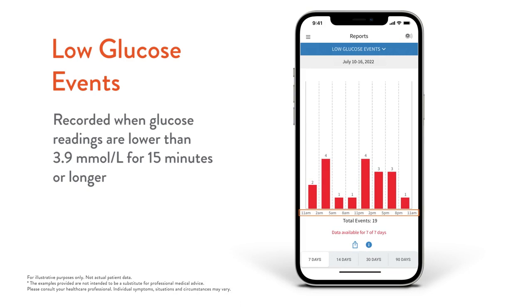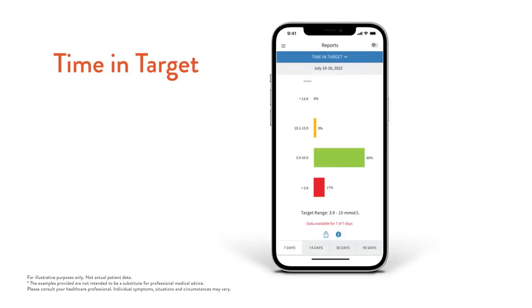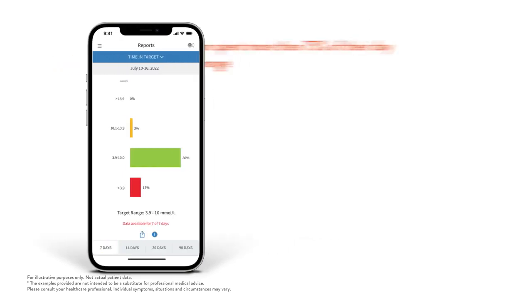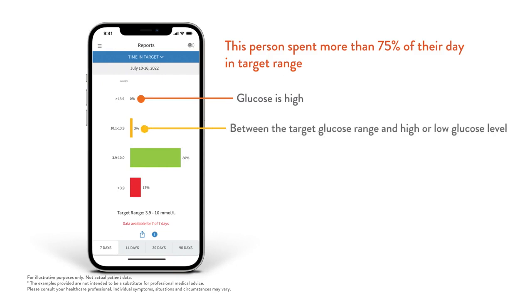Next, let's have a look at the time in target report. Time in target shows the percentage of time your glucose readings were below, above, or within your target glucose range. Here's an example of someone who spent 75% of their day in their target range. Orange shows you when your glucose is high, yellow is when you're above or below target range, green is when you are in range, and red represents low glucose.